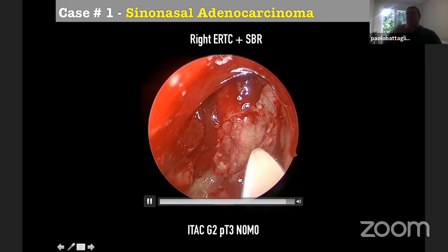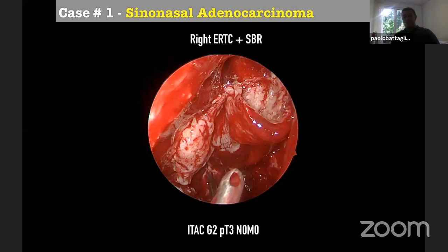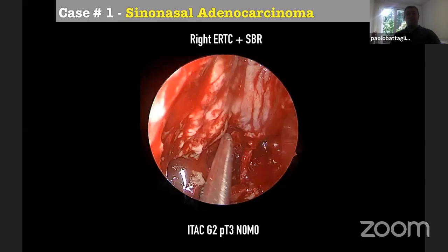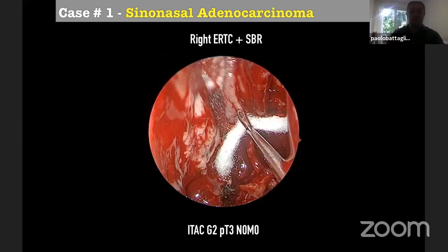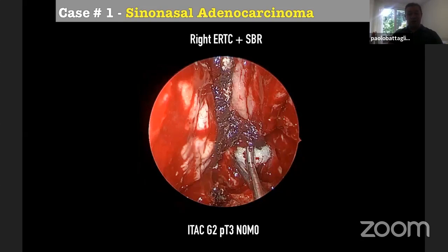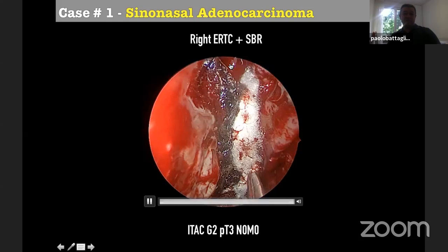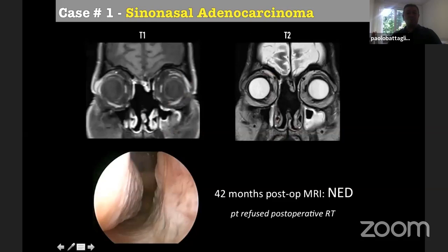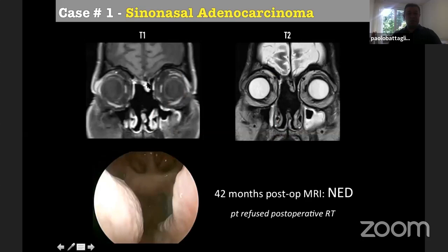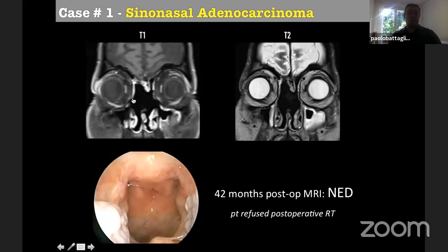Here we used some fat from the leg, from the plastic surgeon, to improve the regeneration of the dura, but it's not the goal of my communication. Anyway, here the flap is turned laterally at the level of the anterior skull base and the periorbit. Let's see here, the flap turns on the anterior skull base and covers also the periorbit.